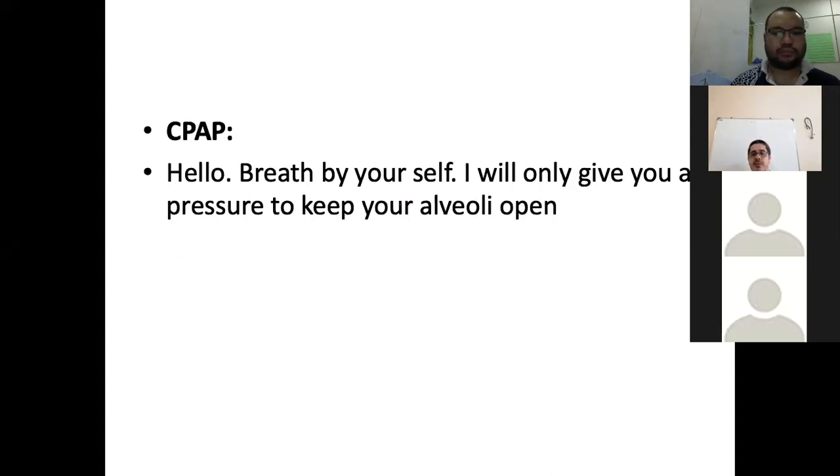Next, CPAP. Hello, breathe by yourself. I will only give you pressure to keep your alveoli open. That's it. CPAP is continuous positive airway pressure, or PEEP, positive end expiratory pressure. So the patient will get the alveoli distended only and will breathe by himself or herself.